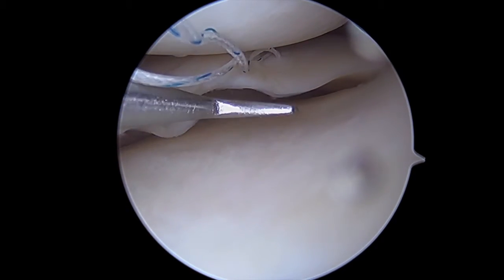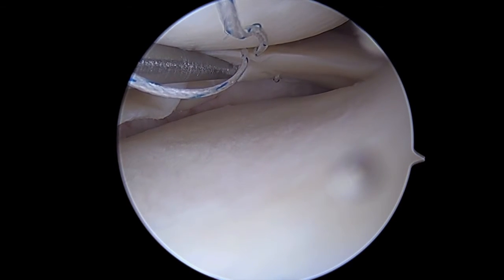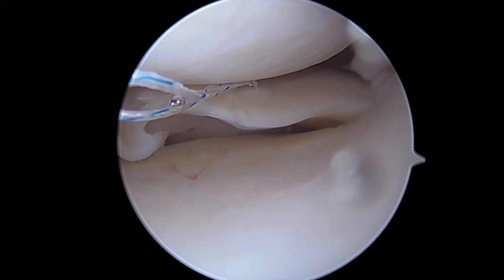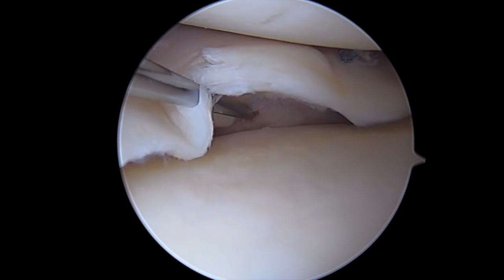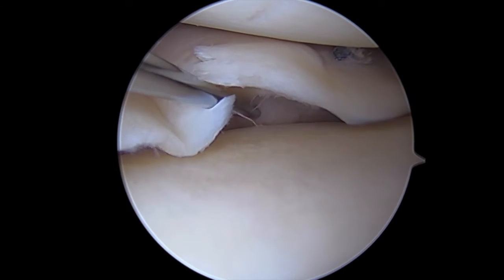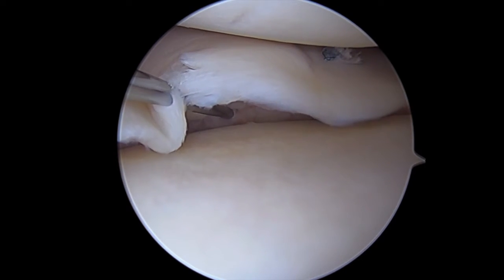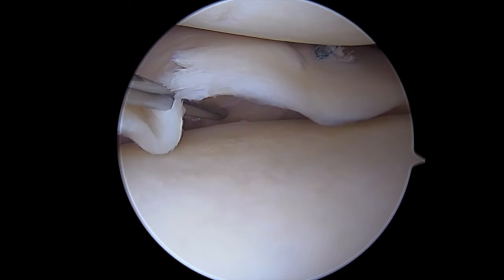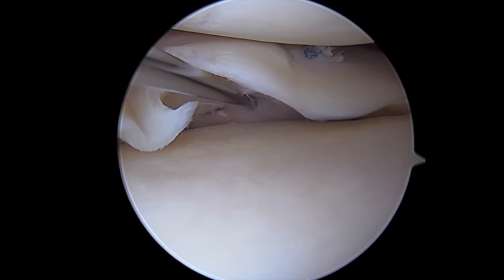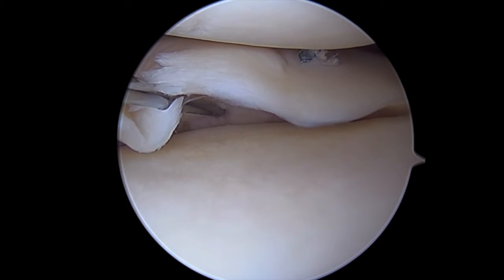I like this stitch. I'm going to trephinate after tying this one to pass another stitch, but on the video you'll actually watch when I try and introduce the first pass, there's too much tension and too much resistance on the needle, so the bottom of the cartridge will actually extend out from underneath the device. This tells me I don't have enough capsular penetration to get the lower jaw through, and I'm meeting significant resistance. You'll actually watch me blow a stitch on this pass because I didn't have enough of a window trephinated.